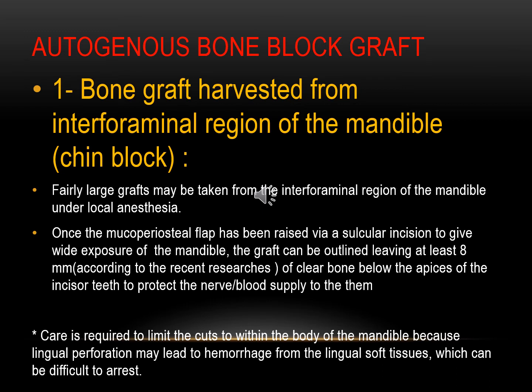We can cut the cortical bone in the buccal side of the chin. Our cutting must be limited to the cortical bone at first.